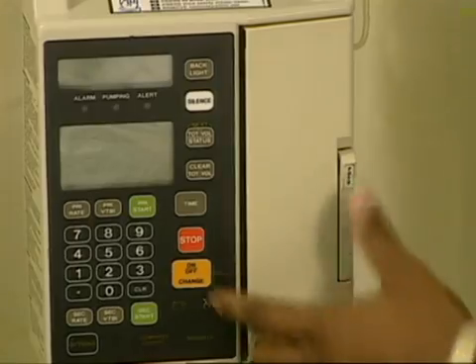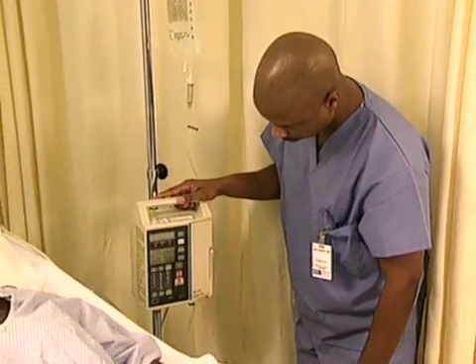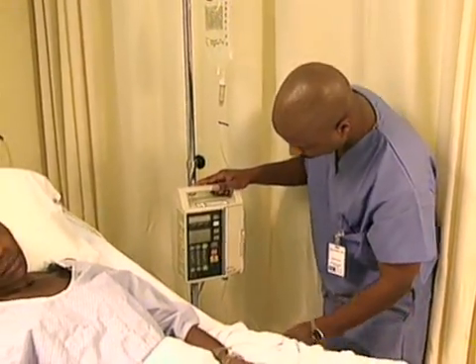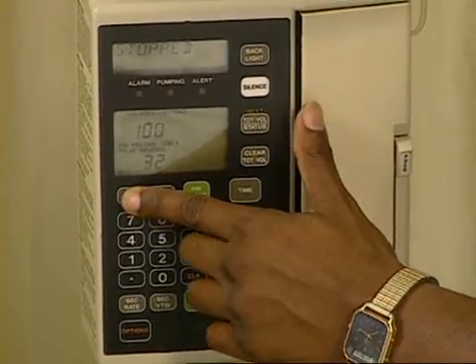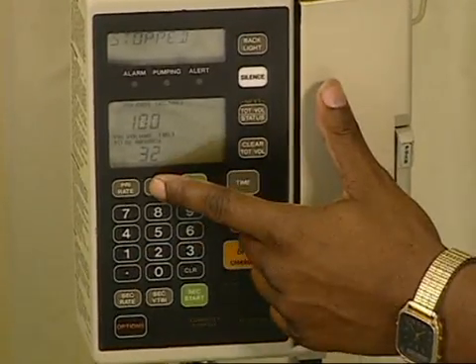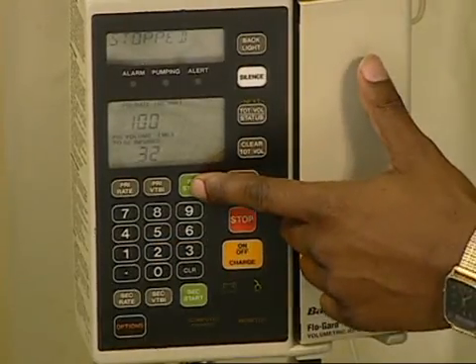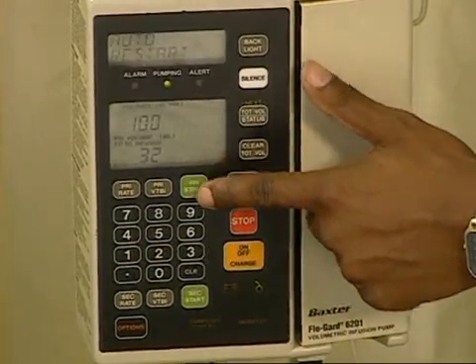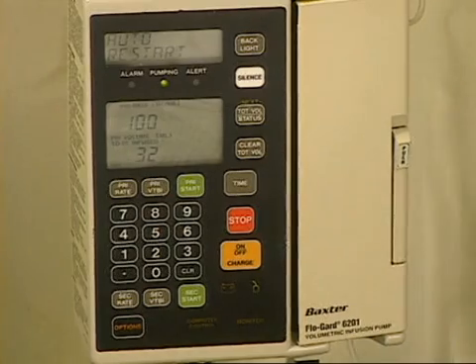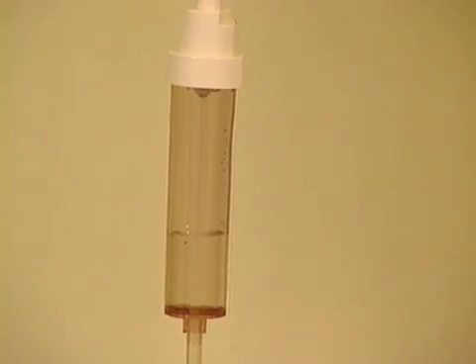A key element of intravenous therapy is maintenance of the appropriate flow rate. An infusion rate that is too slow or too fast can result in circulatory, renal, and neurologic complications. An infusion that is too slow also increases the risk of clotting at the IV site, creating the need to restart the IV. Questions to consider in maintaining the correct infusion rate include the following.